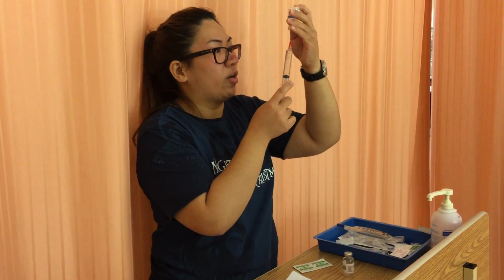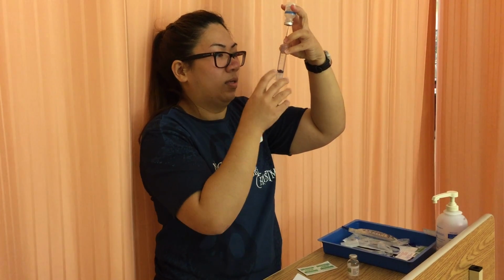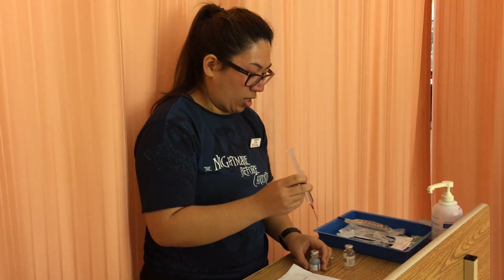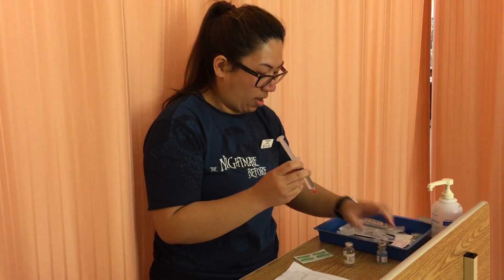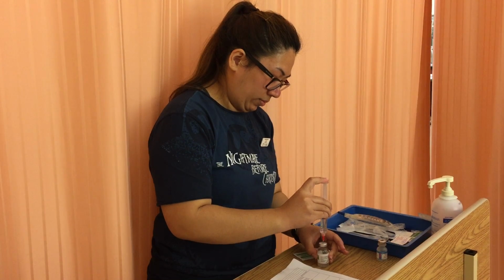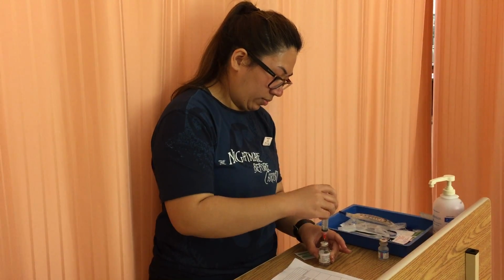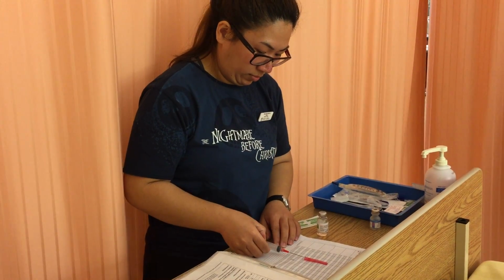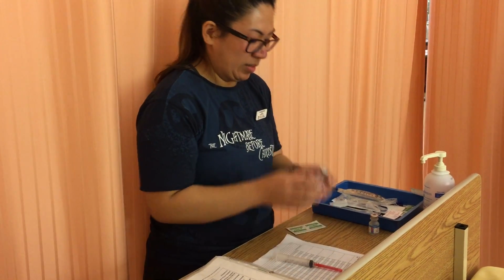And make sure there is no air or bubbles. And now that we have our 10 ml, we can put that in our cefoxitin vial. And rub it through our hands to further dilute the medication so it is well mixed.